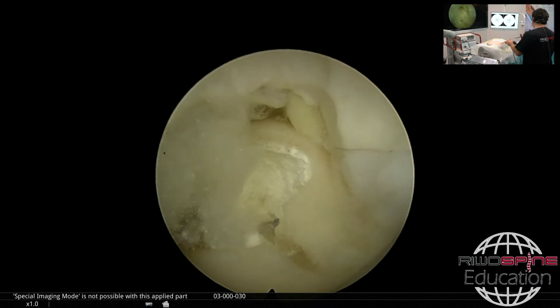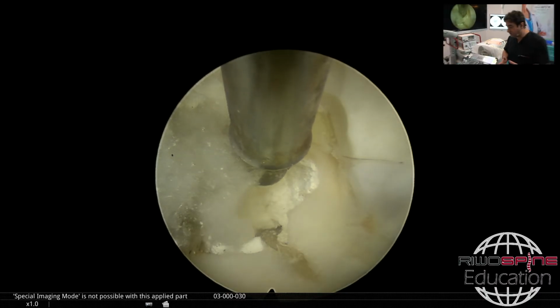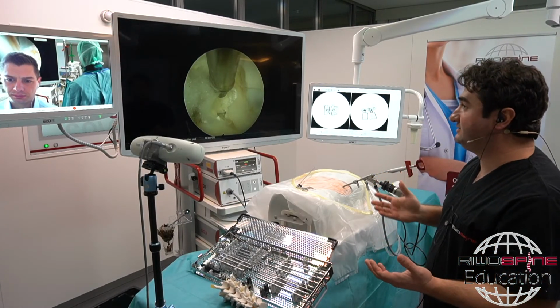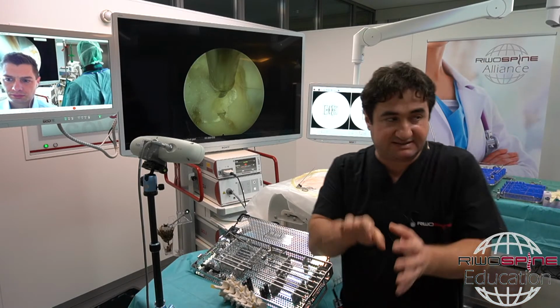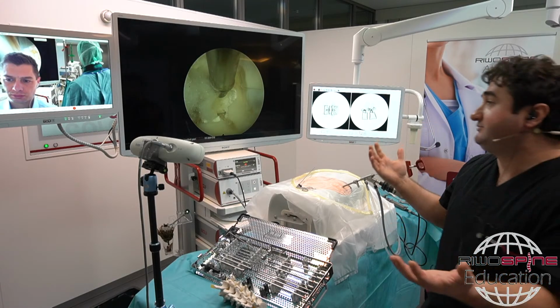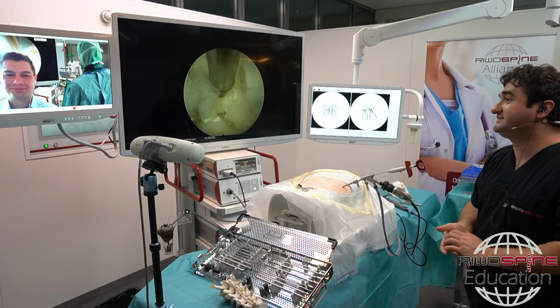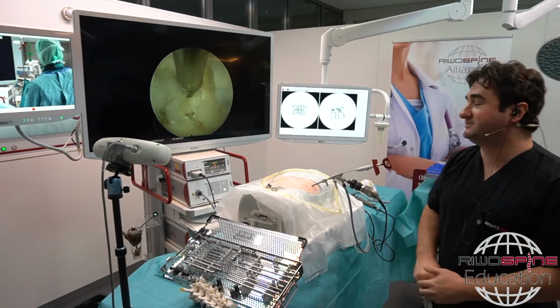Okay, the solution, what I see in the discussions all over the world, you can use banded or flexible instruments to reach there, but again, it's blind, yeah? You don't see what you are catching there. And okay, you see some part of the herniation there, you can catch it, but you have to pray that it's one piece, yeah? You cannot be sure that you did not leave one piece in the caudal side, which can cause the symptoms after the operations.